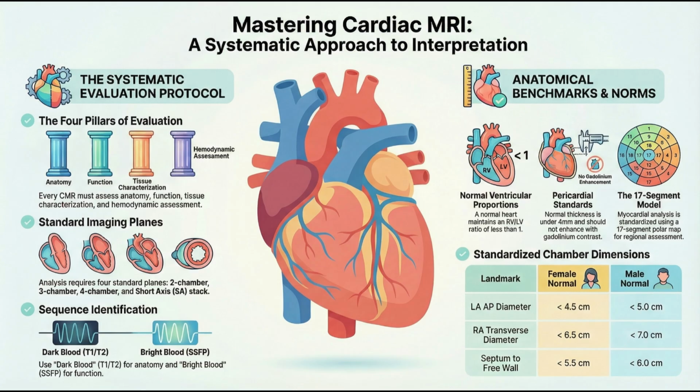You're trying to get this incredibly high-res picture of an organ that's twisting and squeezing and conducting electricity all at the same time. And it's sitting crooked in the chest. I mean, it's a moving target in every sense of the word. Right. And it's not just the motion, it's the physics. I think a lot of people get intimidated because it feels like you need a PhD in quantum mechanics just to set up the sequences. But we're going to try and cut through that noise today.